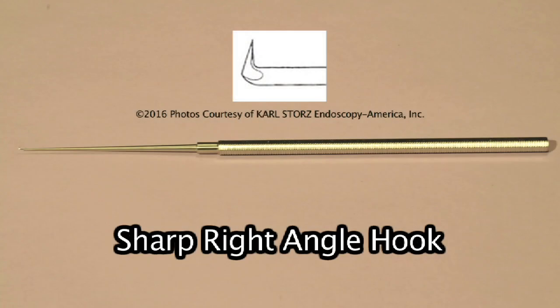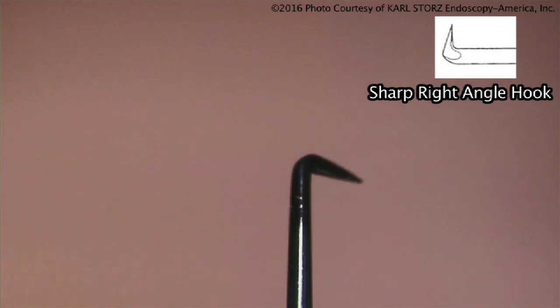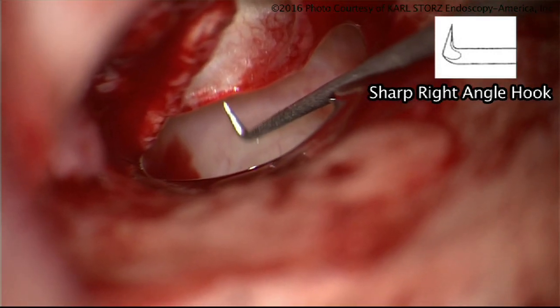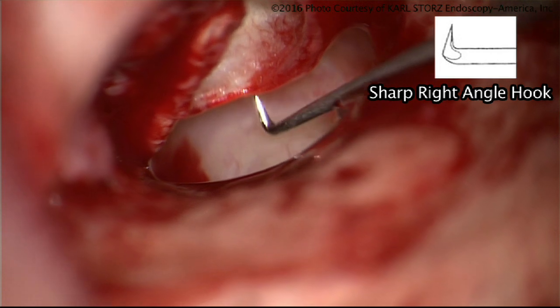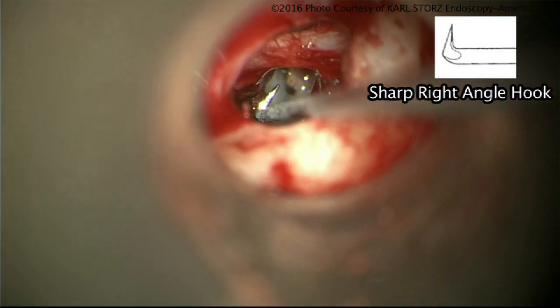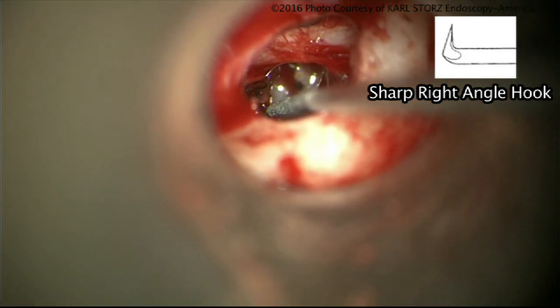The sharp right angle hook is an instrument used to measure distances. It might be used to perforate into an area, to remove an ossicle from the ear, or to dissect around a corner sharply. The right angle hook is very helpful for down-fracturing the stapes superstructure during a stapedectomy, and for reaching around sharp corners.